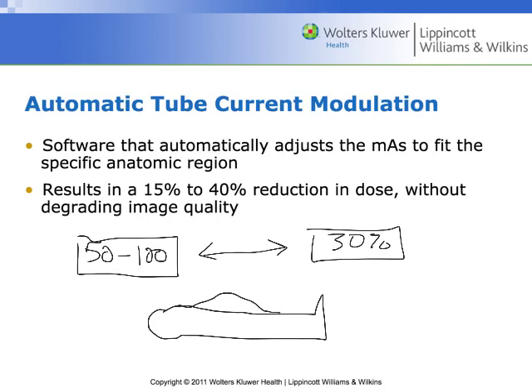It's already pre-planning that. I almost think about this thing like the Terminator robot. You have to kind of outthink the Terminator robot a little bit. Have the person basically naked except for a gown when you're in the CT room. Don't put any shielding on them, and then shoot and do your scout images. Because it's going to start calculating its automatic tube modulation based on that scout image. It'll also calculate some of its iterative reconstruction protocols off of that scout image. So if you forget everything else I say today, know that one of the best ways you can reduce your patient's dose is understanding that the machine does these calcs off of the scout. So no shielding, no glasses, no hearing aids, no car keys, especially no car keys, in the CT scan room.